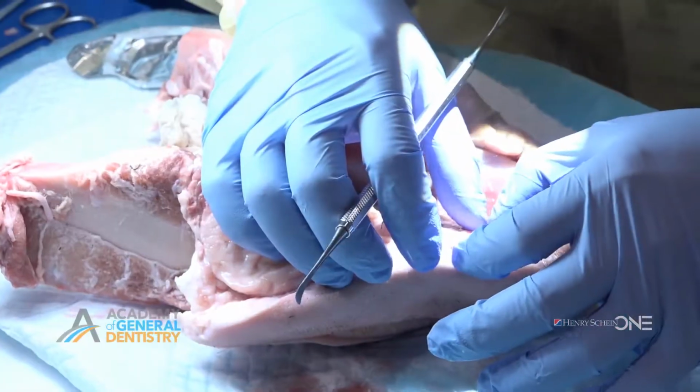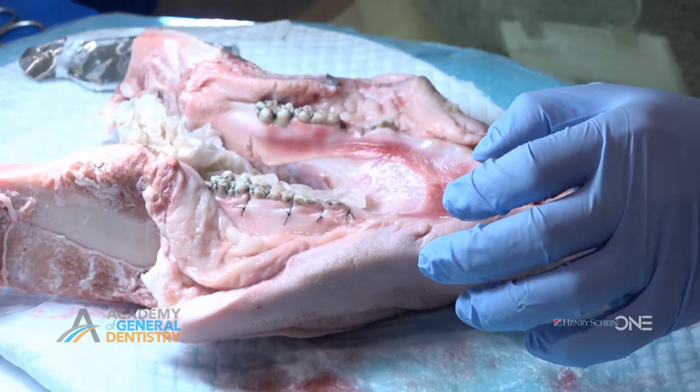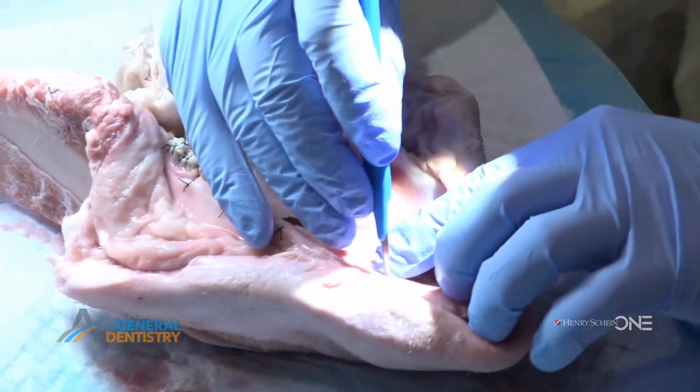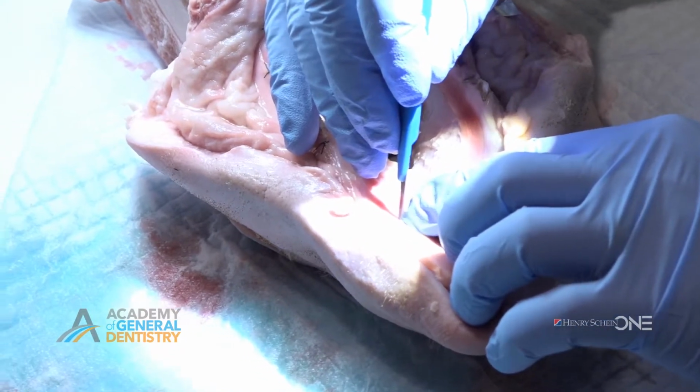Two of the things they learned today: one is how to do a basic flap, taking a margin of tissue on the buccal and then doing a sulcular incision on the lingual, elevating the flaps, accessing the bone, and then of course at the end suturing the patients. The other procedure we're covering is a free gingival graft, where they will harvest a graft and then place it on a recipient site. The model we're using is actually a pig mandible. They seem to be having a good time and learning a lot.